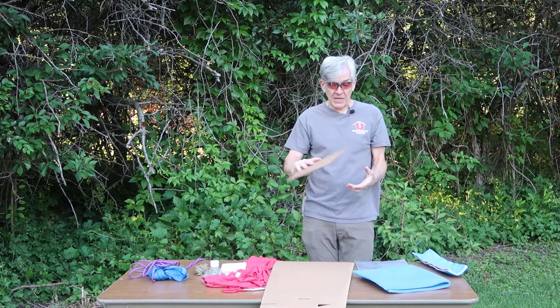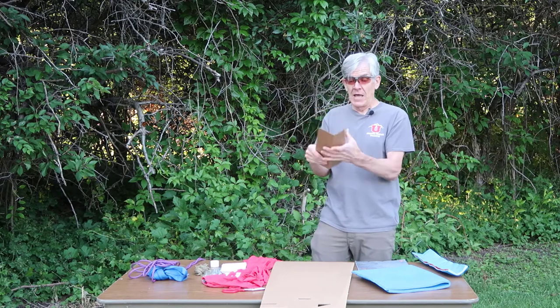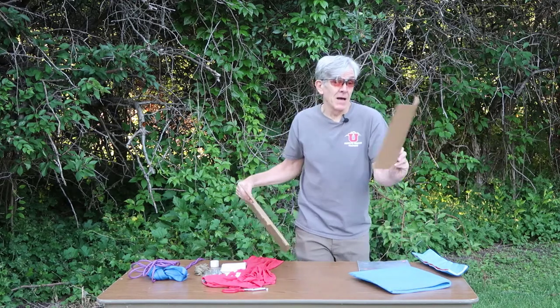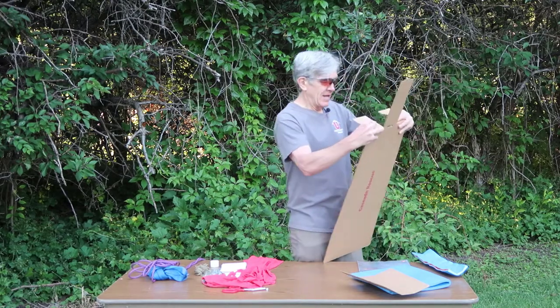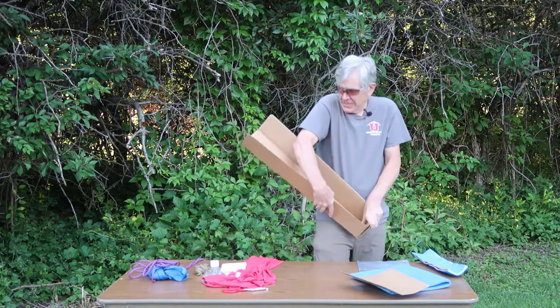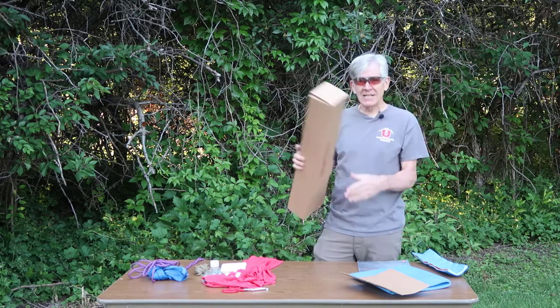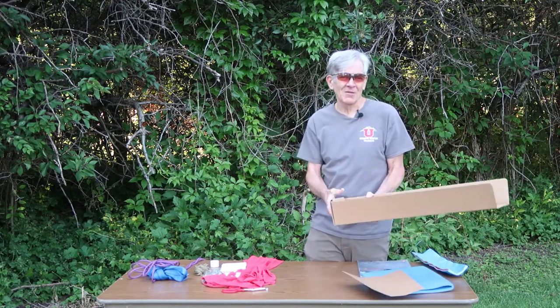Another good splinting material you may have access to is cardboard. Rescue teams sometimes carry this. Here's a commercial cardboard splint by Cascade — it folds up for a forearm splint or, with tabs latched and tucked in, becomes a leg splint. Obviously you could use any piece of stiff cardboard. It's good to see this stuff because you may encounter it on a rescue team, and anything that folds up in the wilderness context can really vary in what you have.